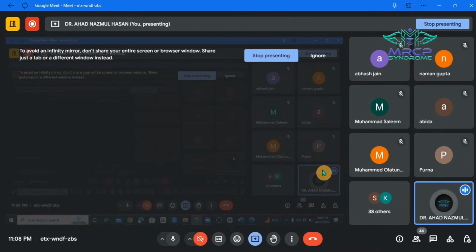And also in case of herpes simplex encephalitis, you should always go for the MRI. Also in the exam, whenever they give you imaging with respect to herpes simplex encephalitis, they will give you the MRI image, and you will get the increased signal intensity in the temporal lobe, either unilateral. In most of the cases, this is unilateral. And also remember another important note.